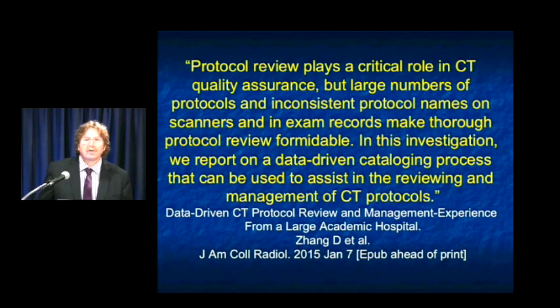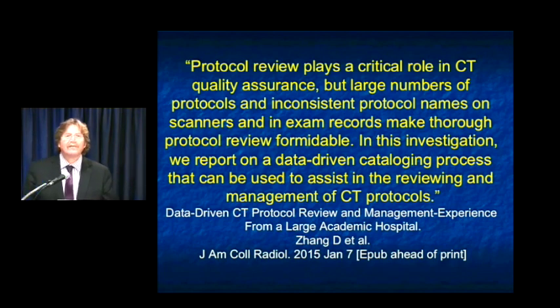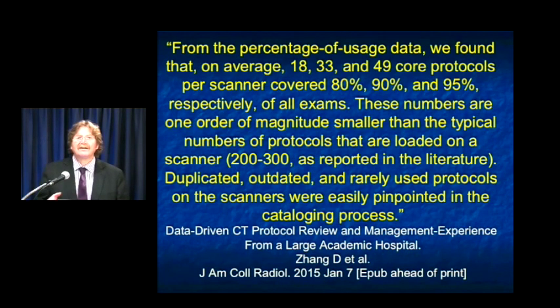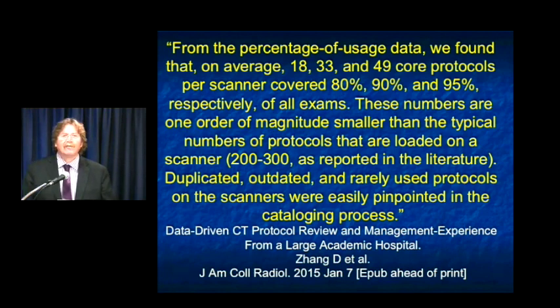Now, one of the things also in terms of protocols is not just doing the right study and doing the right thing for the patient, but also it's a way of doing quality assurance. Protocol review plays a critical role in CT quality assurance, but large numbers of protocols and inconsistent protocol names on scanners and in exam records make this a problem. There's a really good article by Zhang that made the point that on their scanners they found so many protocols, and often the protocols were redundant. They were just added on new protocols. You might have 6 pancreatic protocols, 7 liver protocols.